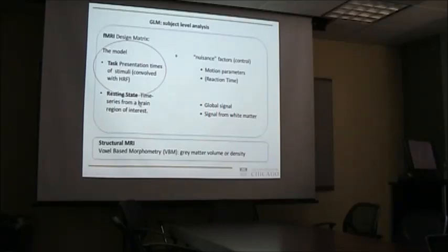We're not going to really talk about this too much, but you could do a similar thing if you want to analyze your resting state fMRI data, which has become really popular in fMRI research. You could analyze your resting state data in a pretty similar way as your task fMRI, only your model would not be the onset of certain stimuli, but the time series of some brain region of interest.